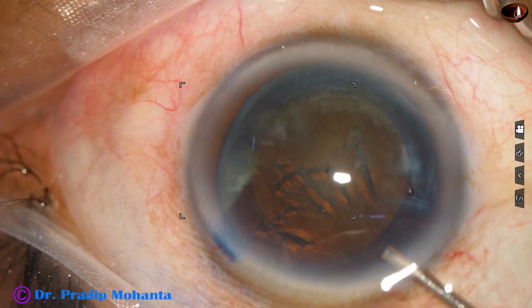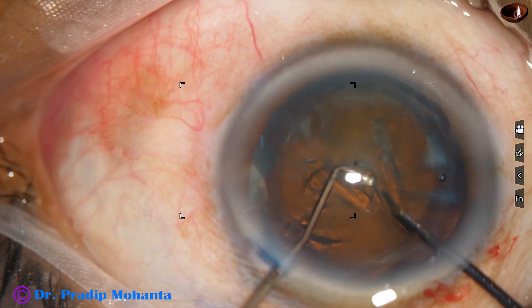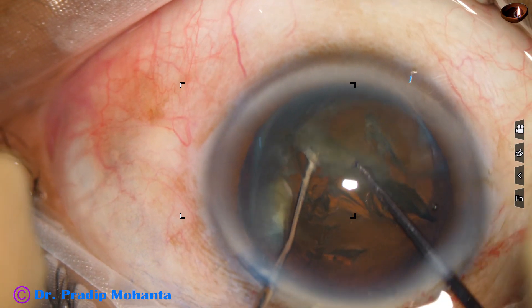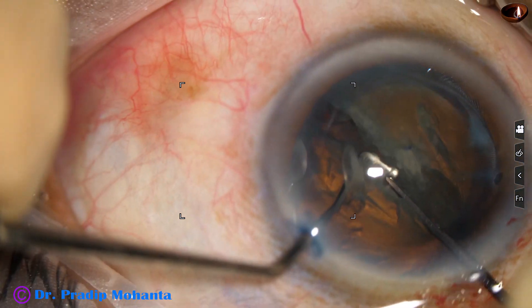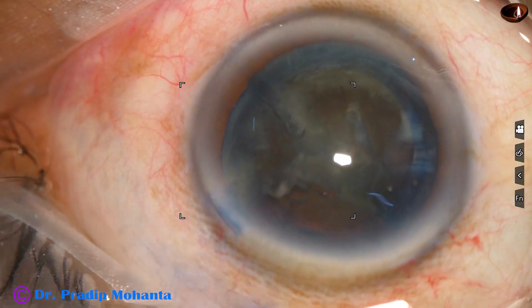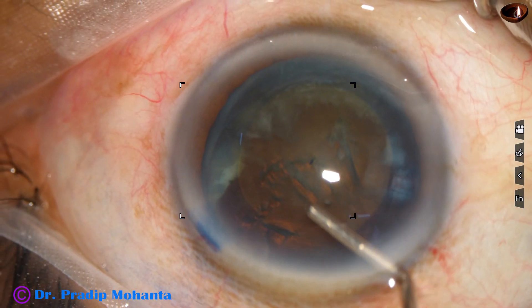The nucleus was not rotated. Now here goes the pre-chopper — this is at real-time speed. Let us now see the use of the pre-chopper in slow motion. This pre-chopper has been designed by Dr. Suhail Irfan Khan of Nanded, Maharashtra, India.